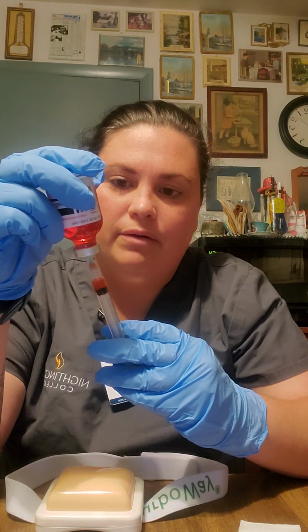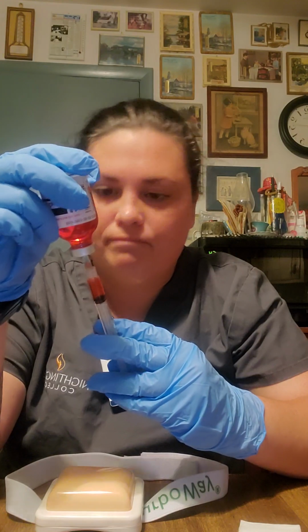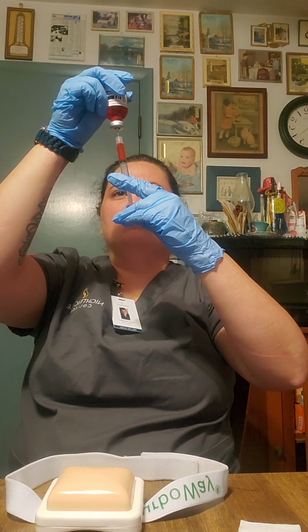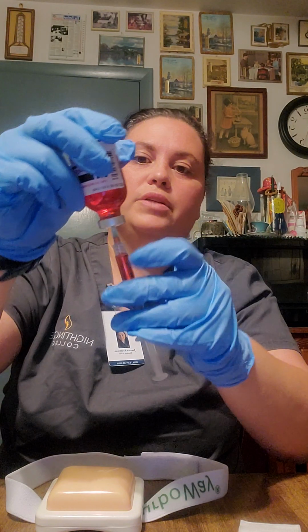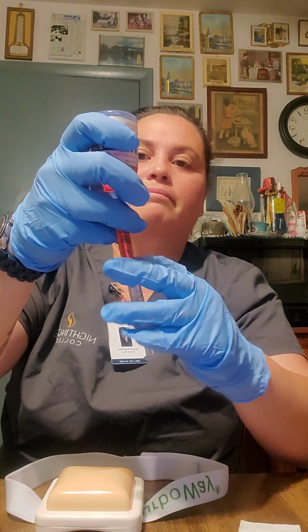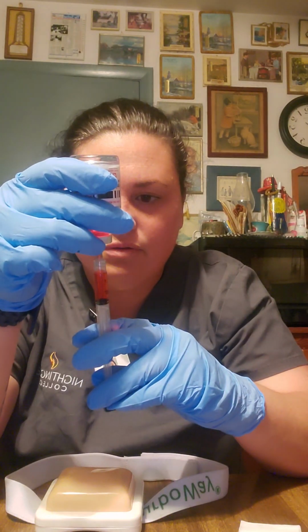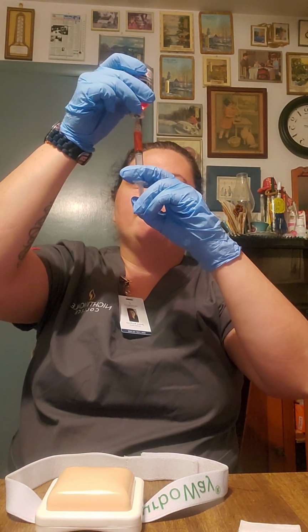So I'm going to come down here to 1.5. Okay. I don't see any air bubbles, but if I did, I would flick the top, or I would push up and withdraw down to that 1.5 mark.